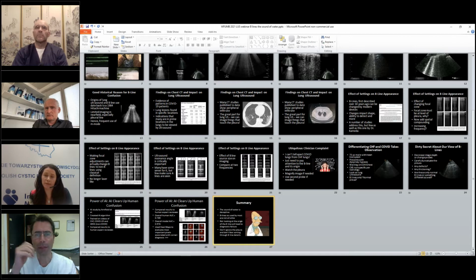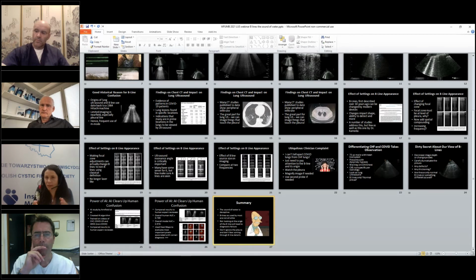Yes, I believe that after relatively short training, we are able to equip general physicians, pediatricians, internal medicine specialists with basic knowledge of the ultrasound findings, which could help them to differentiate and to take, for example, the decisions on hospital admission. Exactly, differentiating between bronchiolitis and pneumonia in younger children would be especially of great help.